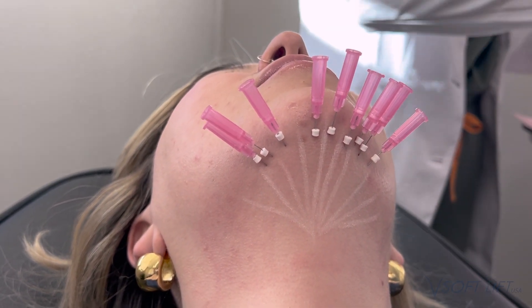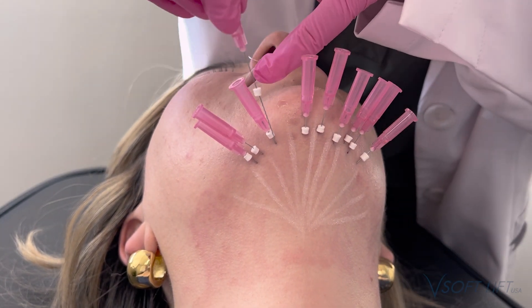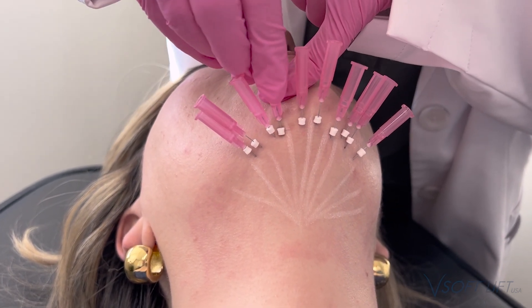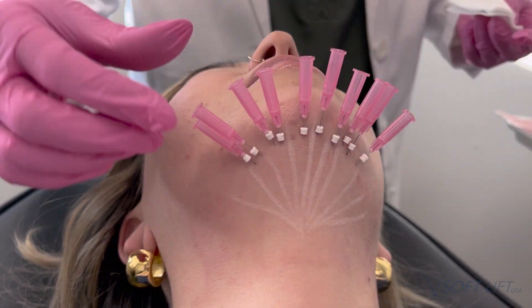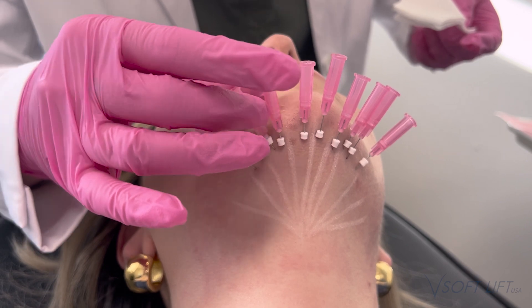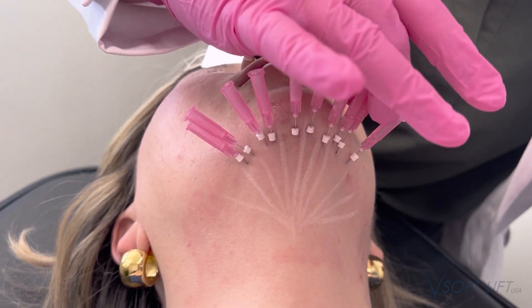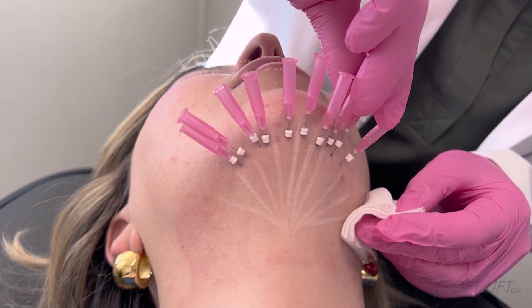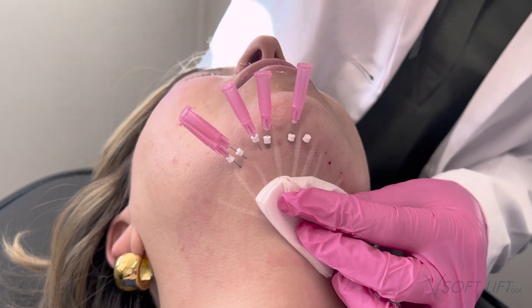So far we only have results from that first treatment in this photo, and she's already starting to see great results. We will continue to take a series of photos — results from this current treatment will be captured in four to six weeks when we schedule her third and final treatment.